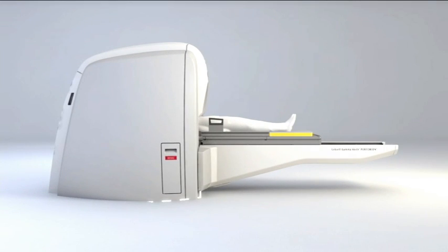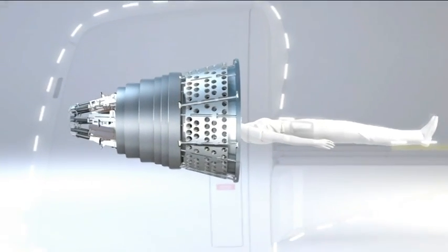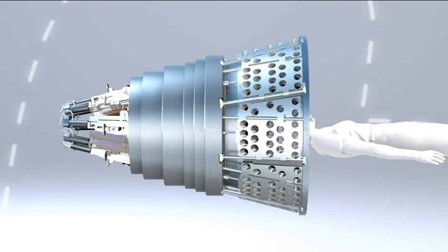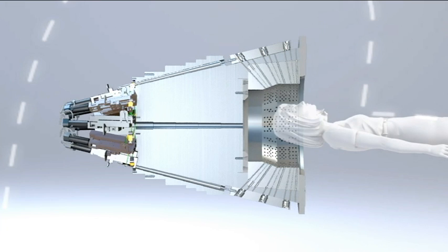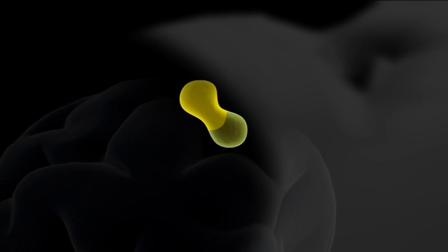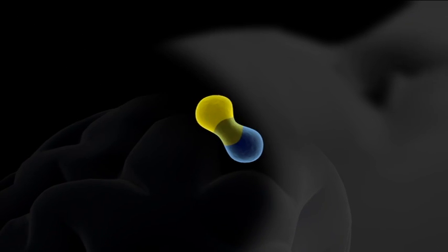Gamma knife surgery is a unique method that delivers extremely focused radiation beams to the target in the brain. The patient's head is positioned inside the radiation unit. During treatment, all radiation beams meet in a focal point with submillimeter precision. The individual beams are too weak to damage healthy tissue on their way to the target area, but very powerful when they simultaneously merge at a single focal point. This can be compared with the principle of a magnifying glass in the sun.